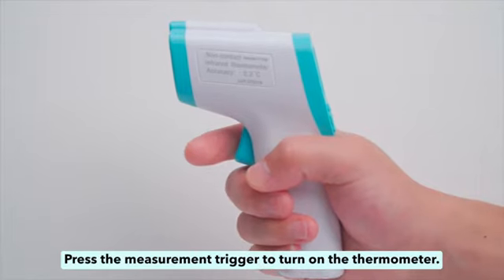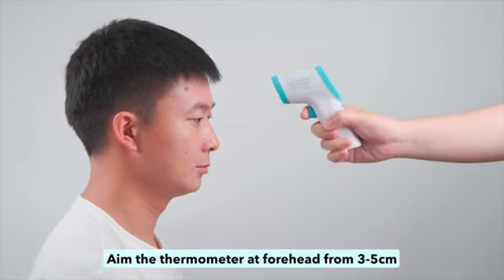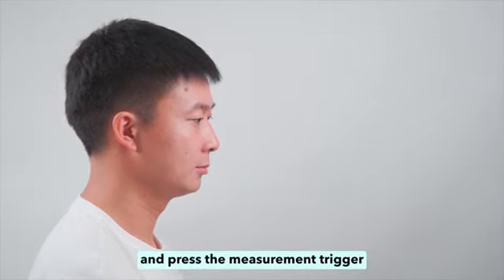Press the measurement trigger to turn on the thermometer. Aim the thermometer at the forehead from 3 to 5 cm and press the measurement trigger.